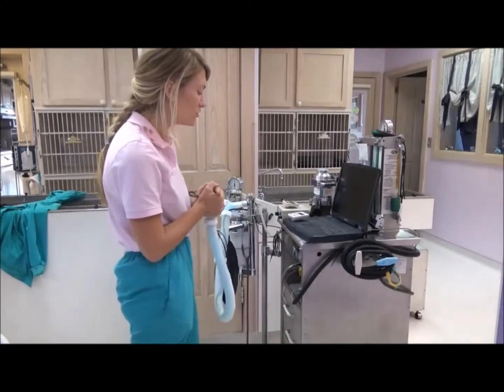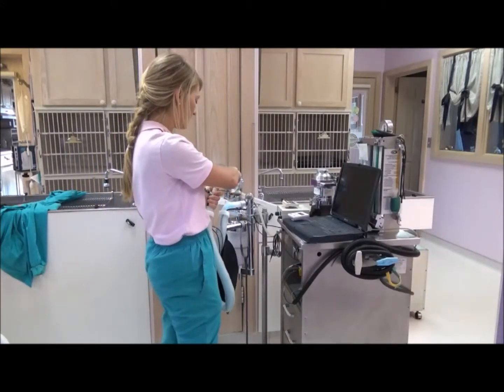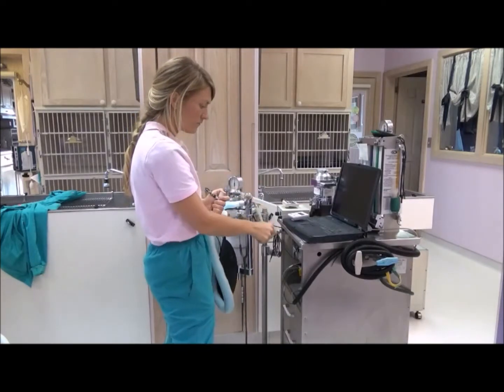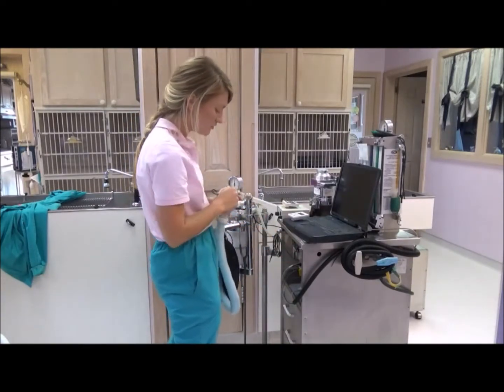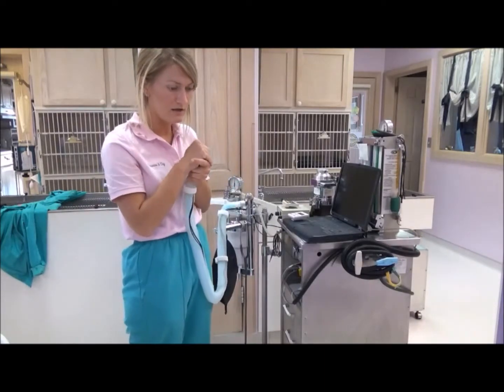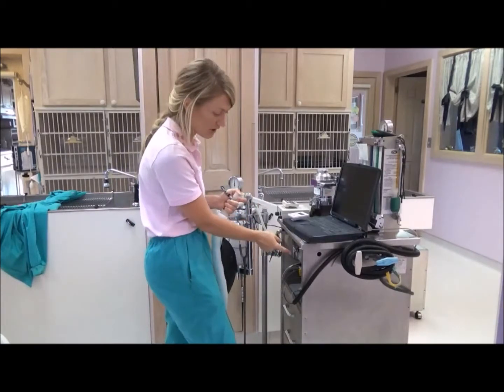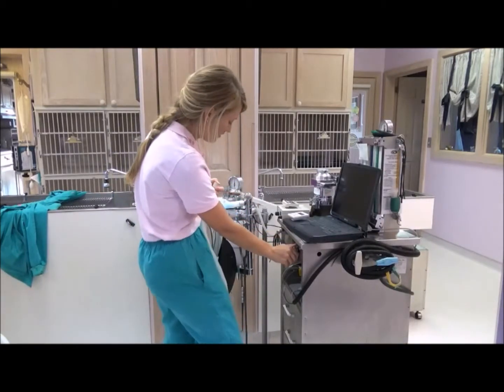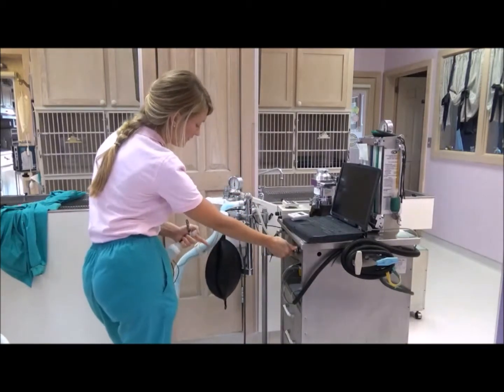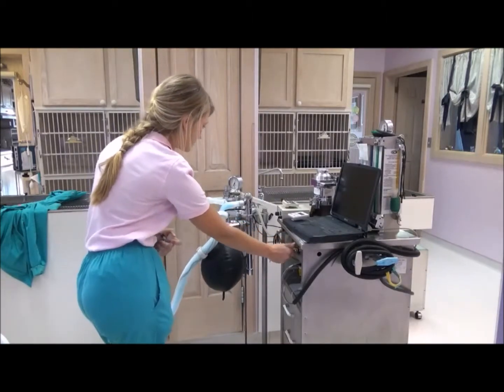So then what you want to do, you want to make sure that you close the pop-off valve. And then make sure that you tightly cover the end of the rebreathing hose with your hand. You just want to be careful that you don't let any air escape once you turn on the oxygen flush. And you're going to fill the rebreathing bag up until the pressure on the manometer reaches 30.